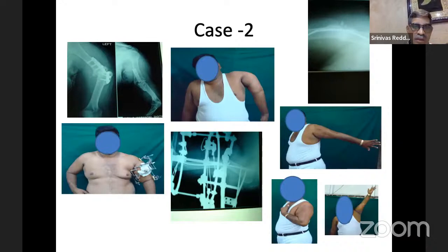And this is a very difficult non-union. It's a 12-year-old non-union with a broken plate, and hypertrophic, elephant-foot type of ends, but very resistant. Plate removal, exposure, resection of the ends, and application of the fixator. Generally the time period in these is nearly 8 to 9 months for the fixator removal. And again here also a small Rush pin is passed and it united well.